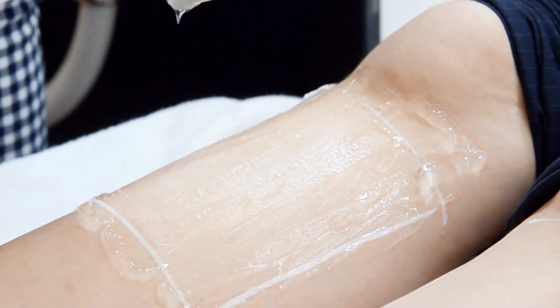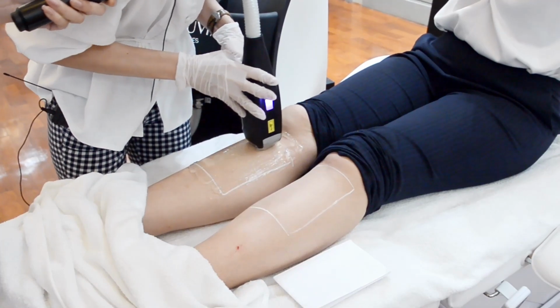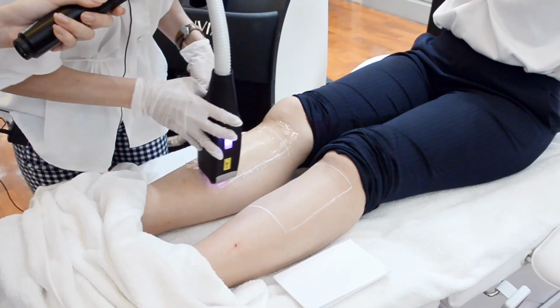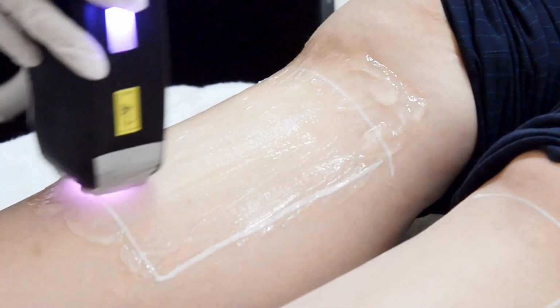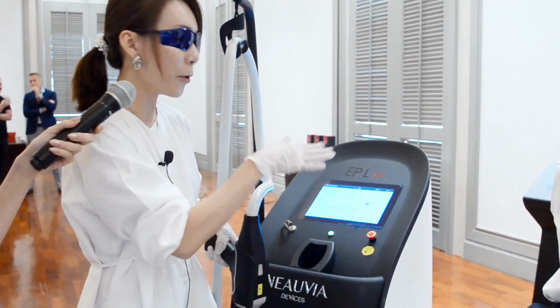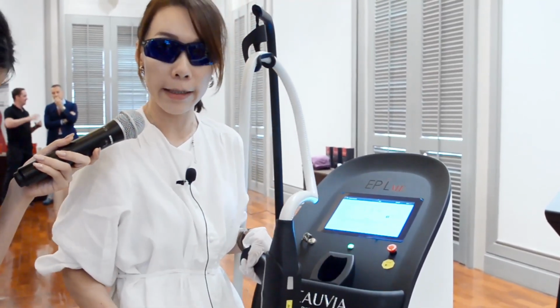How do you feel? Is it okay? It's comfortable? Okay, good. Always check with your patient how they feel, especially if it's a first time test patient for epilation. Okay, do you hear the 2 beep sound? It means that this area is completed. So it actually helps, you don't have to keep looking at this bar for it to finish. It's actually alerted by these 2 beeps. So this area is completed treatment, so you can move on to the next area.